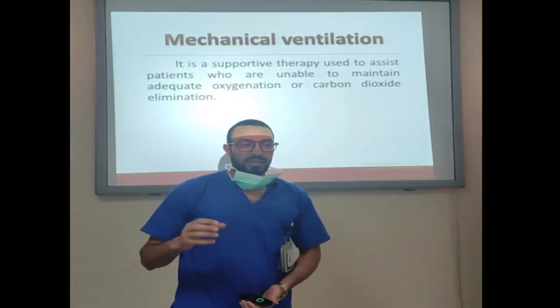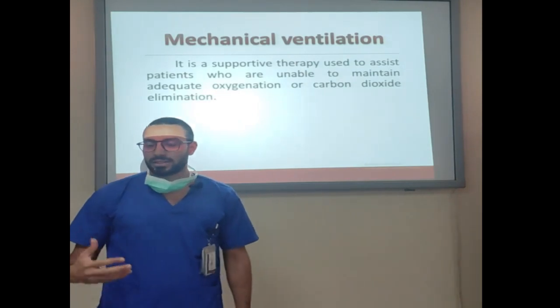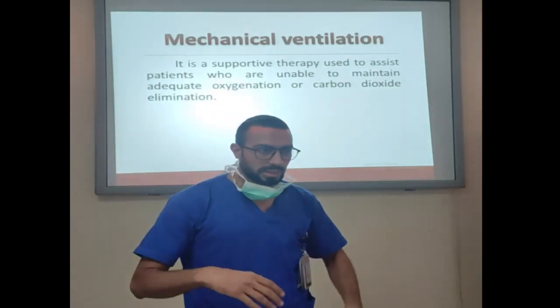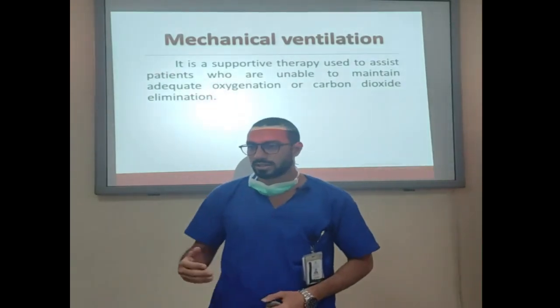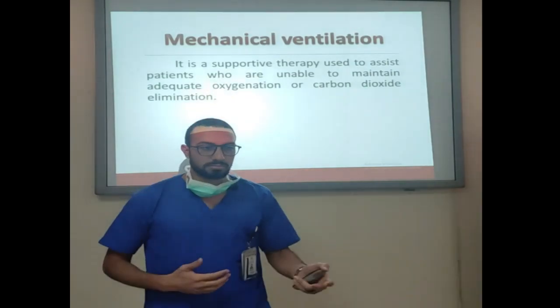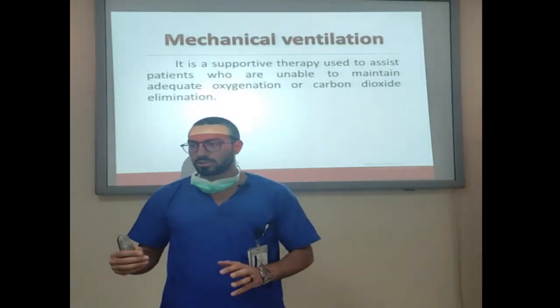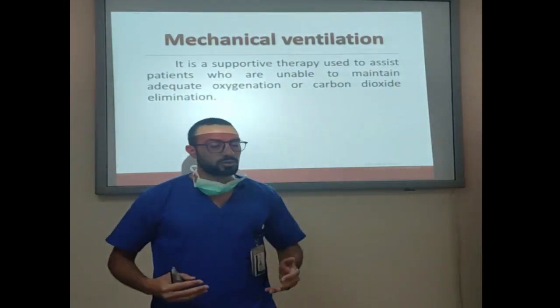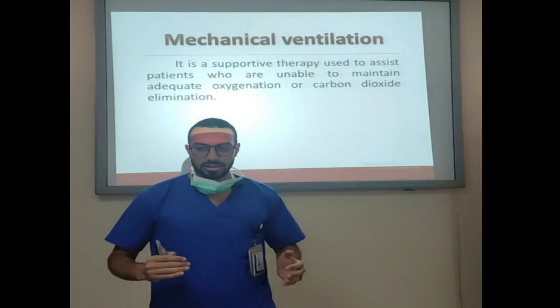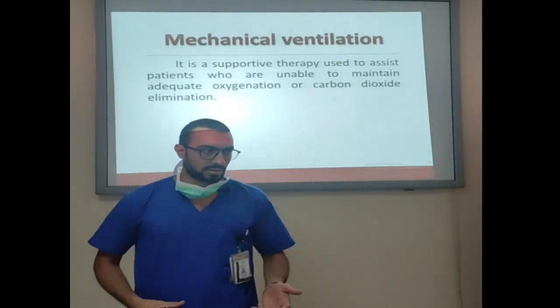First of all, what is the definition of mechanical ventilation, and why did we need to invent something like the mechanical ventilator? You know, sometimes we have many problems in some patients, like problems regarding the airway, how to protect our airway, and some problems regarding the breathing. And we have other problems related to the gas exchange or the function of the lung itself. So according to all this, it's a must to have a device that can ease this process.